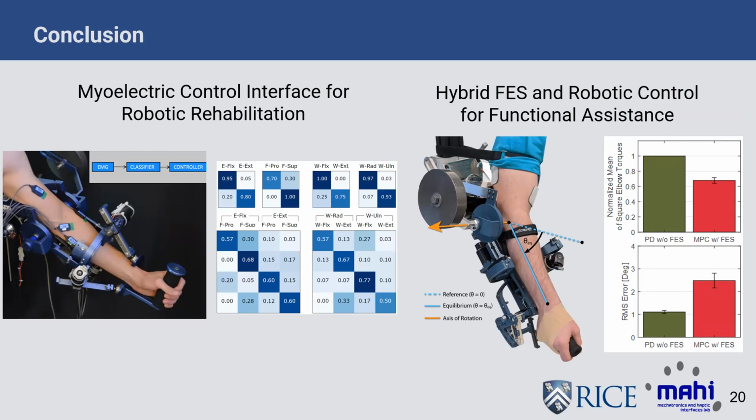So I try to tune that beforehand. There's some manual controller tuning that's done to make sure that it's still comfortable. But in terms of using FES, it really does feel like you're using your own muscle. So there hasn't been much response in terms of preference; as long as it's in the realm of comfort, it hasn't been a big deal between users.